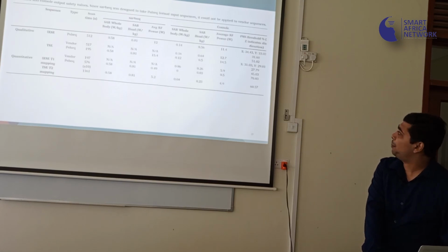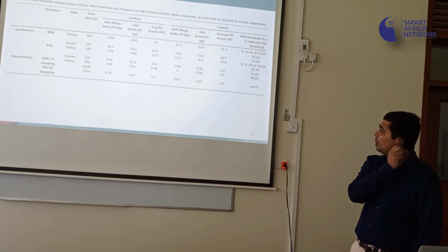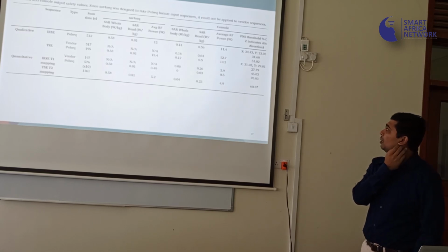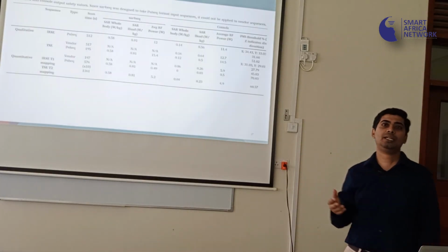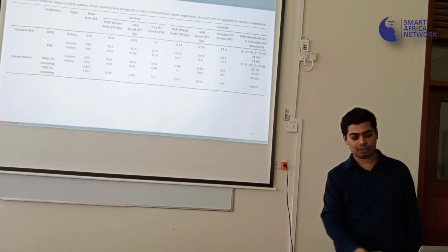Here are the results comparing those quantitative imaging and qualitative imaging for safety as well, where you see the specific absorption rate with our own open source tool, which benchmarks again to a Siemens and a GE, that shows that if you use our safety assessment tool, you should be okay.